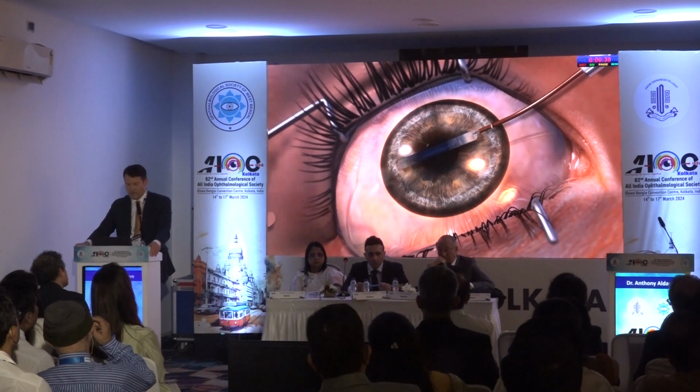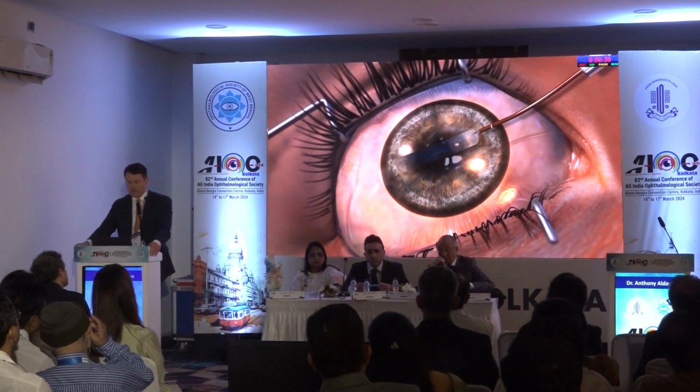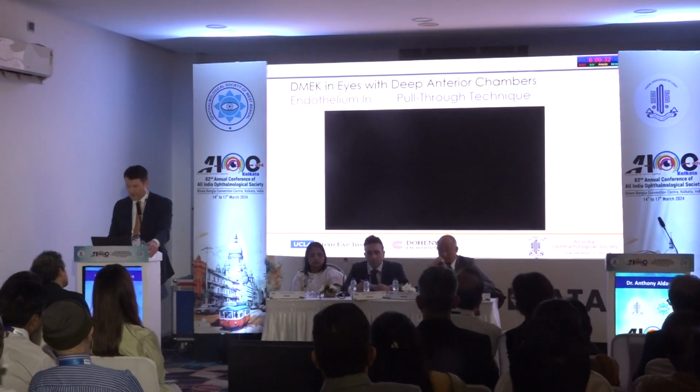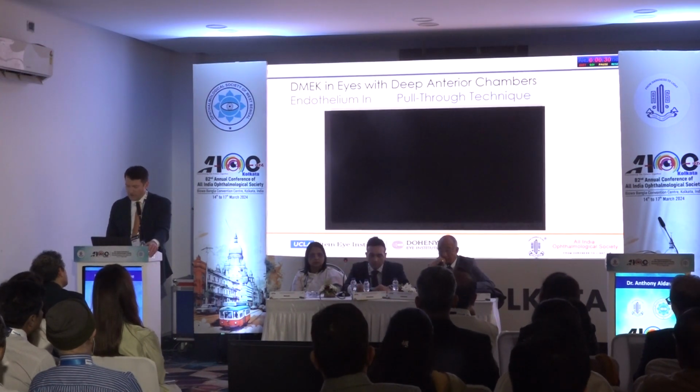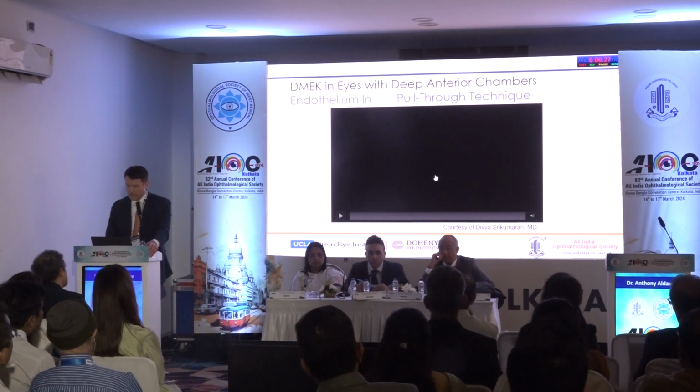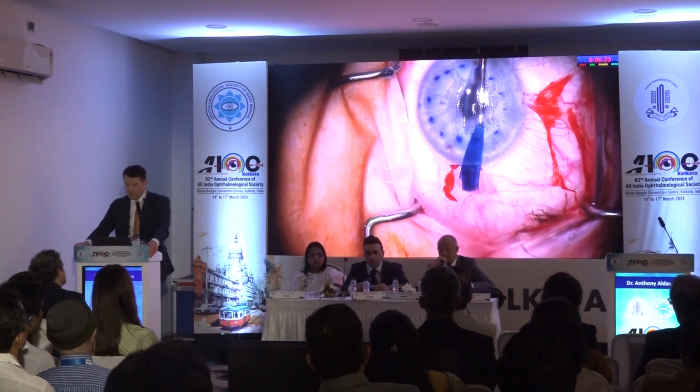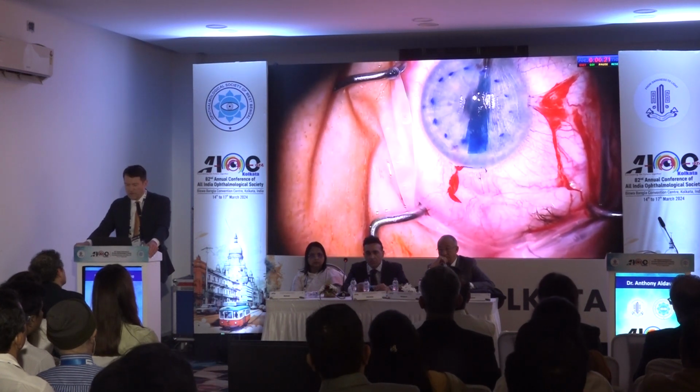You could use an AC maintainer as well if you wanted, but in this case, since the flow is coming from those forceps, that flow helps to unfold that graft. Now, I'll show you this in action. This video is courtesy of Divya, who just gave this to me, who many of you know. So here's a case of hers, in which she's using these forceps. This graft, again, is endo-in.